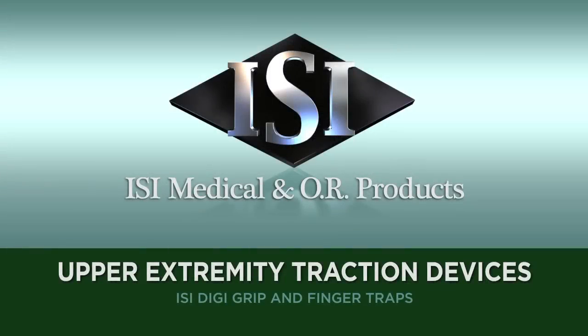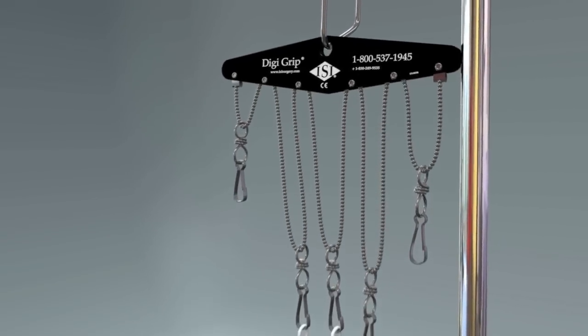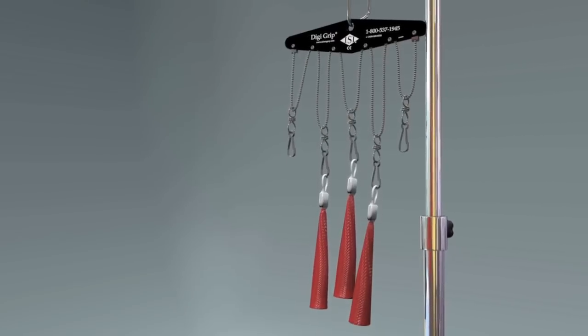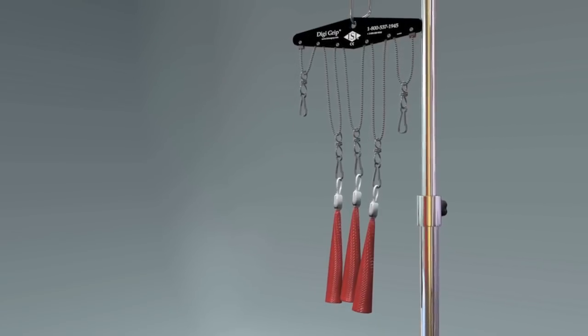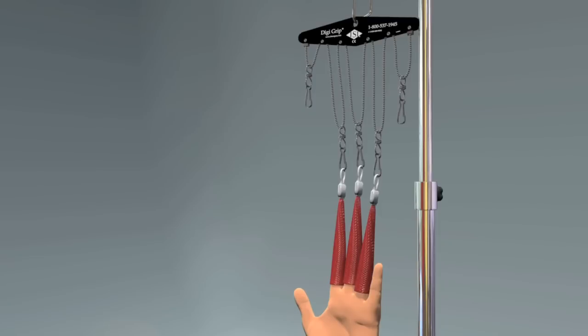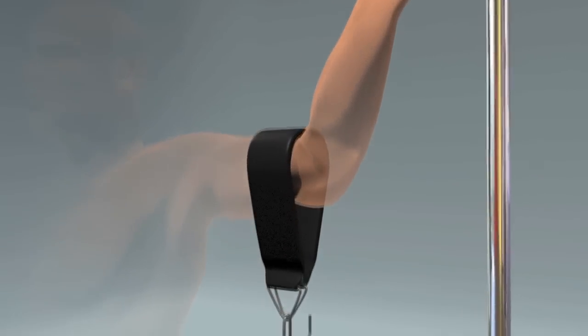DigiGrip and Finger Traps. The ISI DigiGrip system provides secure traction of the upper extremity. Used with an IV pole or a traction apparatus, the ISI DigiGrip allows up to five finger traps to be easily attached or changed.